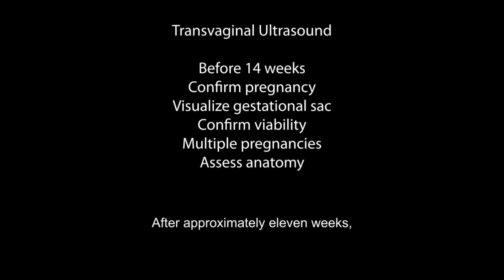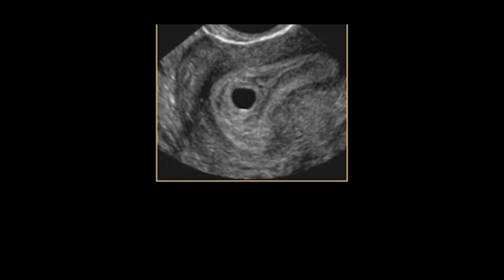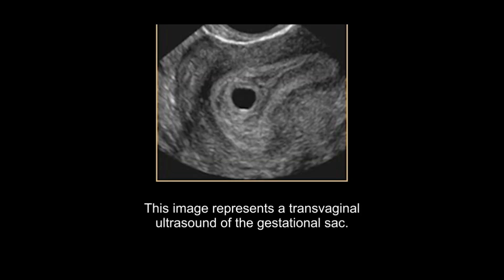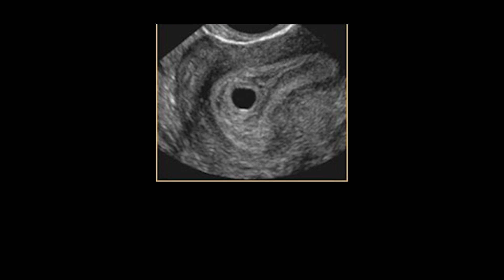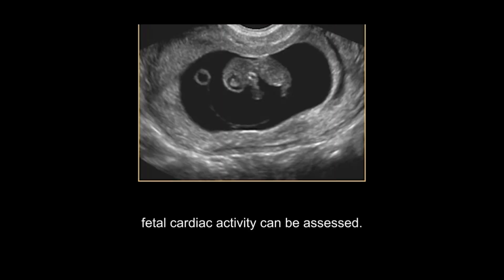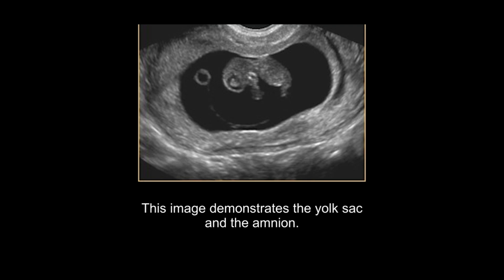After approximately 11 weeks, basic anatomy can be assessed. This image represents a transvaginal ultrasound of the gestational sac. In the first trimester, fetal cardiac activity can be assessed. This image demonstrates the yolk sac and the amnion.